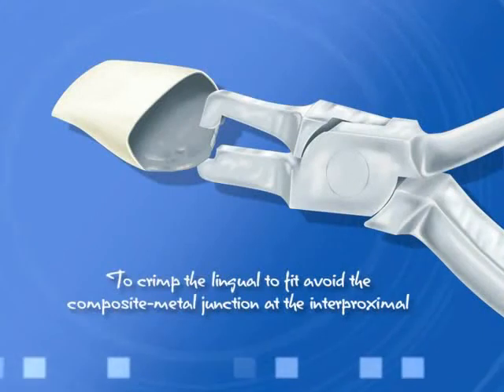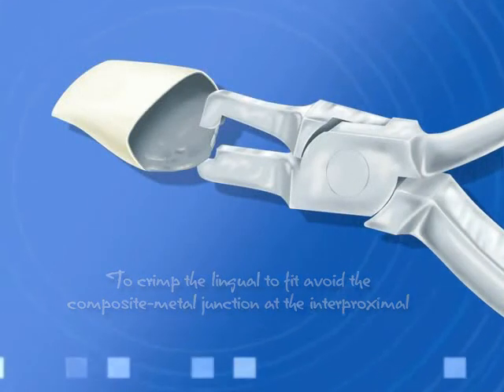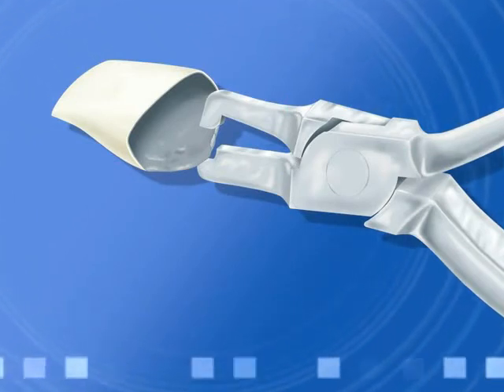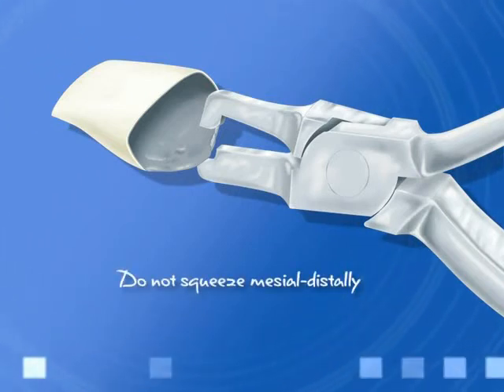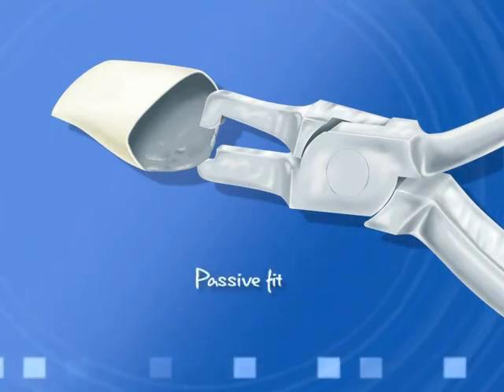Crimping. If you would like to crimp the lingual to fit, stay away from the composite metal junction at the interproximal. Before applying the composite, we squeeze the crowns mesial distally to round them out and to make them less ovoid. We also crimp the facial before the composite is applied. The crowns cannot be squeezed mesial distally, or you could create a fracture line. When crimping, keep in mind that you want a passive fit.